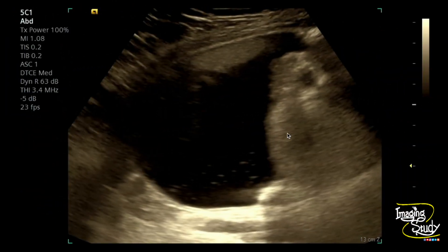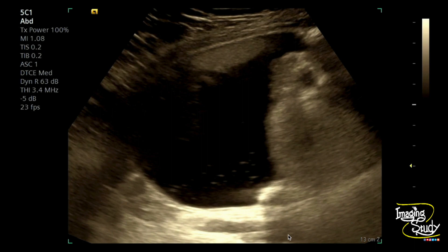Here you can also see those fat balls, and this is the ovarian stromal tissue. You can see the calcified area casting posterior acoustic shadows, indicating dental components or other calcified structures.